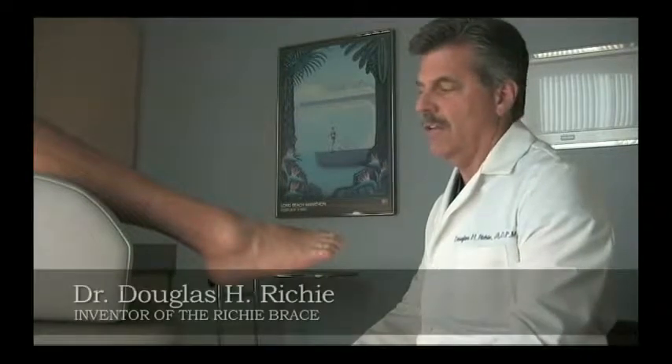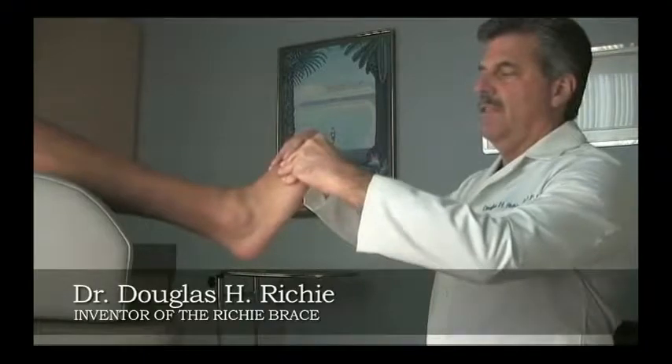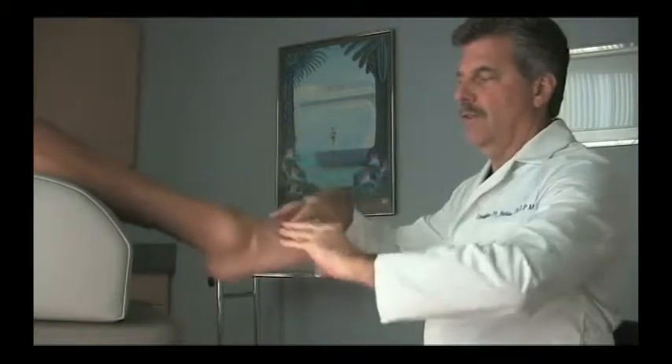We're going to demonstrate a patient with a flaccid drop foot who's an excellent candidate for the Richie Dynamic Assist Brace. The criteria for that particular brace is the fact that the patient has a flaccid drop foot. Even when asked to hold the foot dorsiflex, the patient is unable to do so.